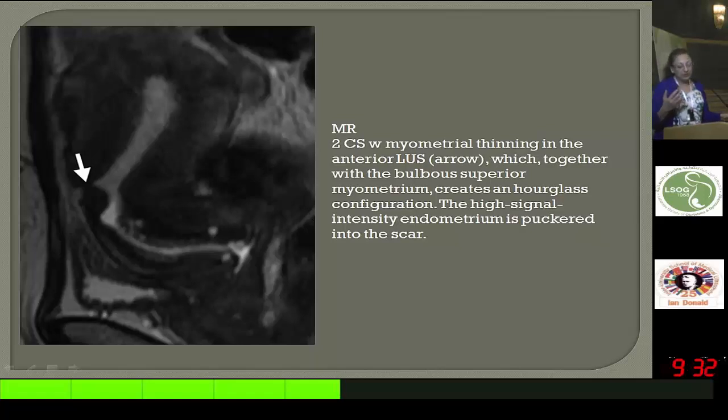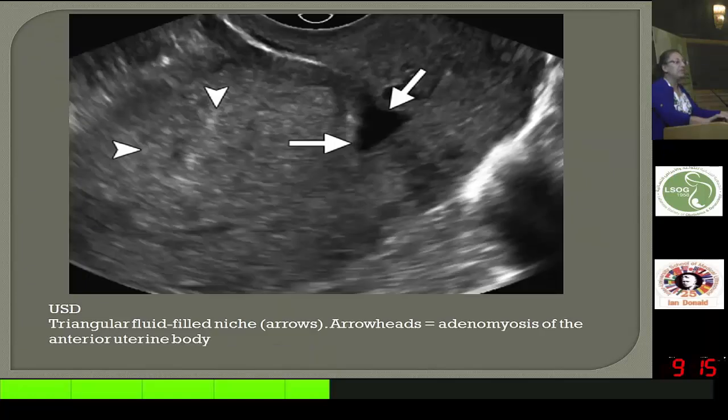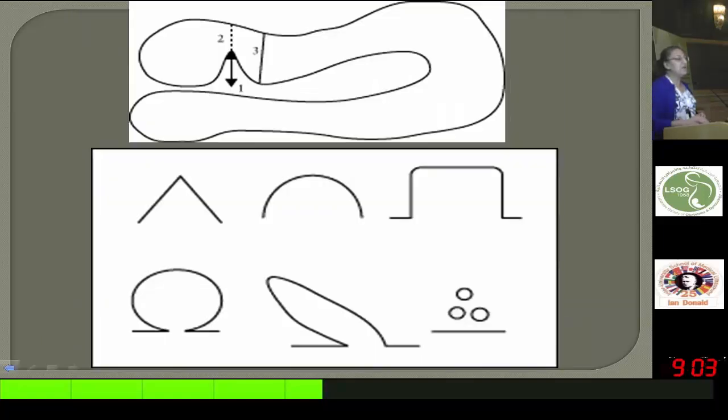And this is important because there are studies that would like to correlate the remaining residual myometrial thickness with subsequent uterine rupture in the future. No correlation has been established, but there are certain things that are limited. So this is what we call an invagination or reflection or indentation in the area of the scar. Sometimes it is triangular in shape. This is what we call the depth of the niche.